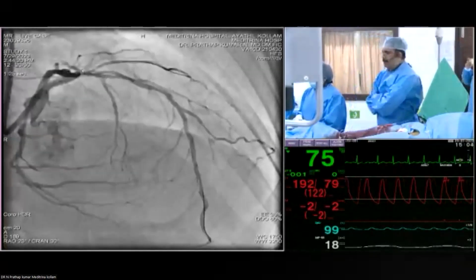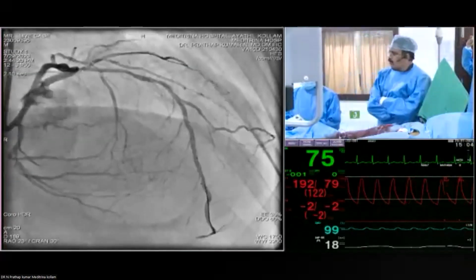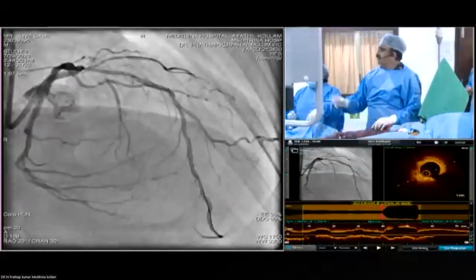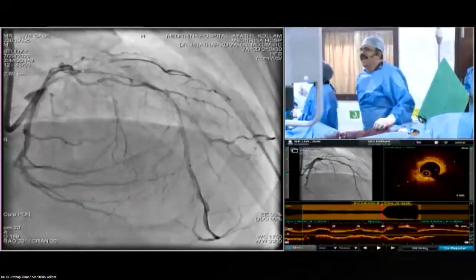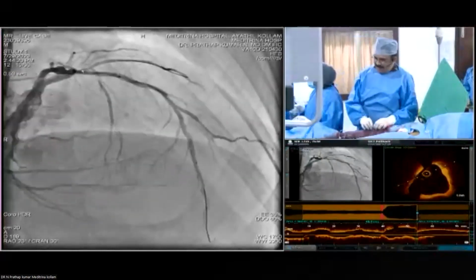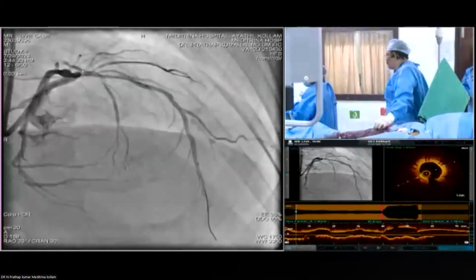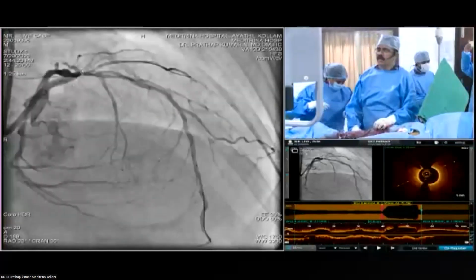I think that looks right to me, but I'll ask the other members of the panel. At least based on my experience and the data, that seems to be the best strategy here. What do other people think? Everybody seems to be in agreement. There are lots of head nods. Saurabh, you understood, people are agreeing with me. Thank you. Dr. Kumar, please go ahead with your DK crush approach, and we go back now to Dr. Chandra.